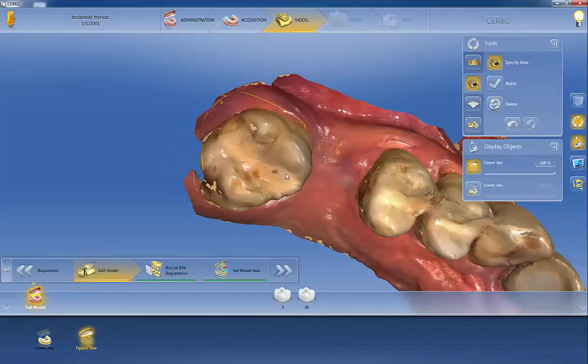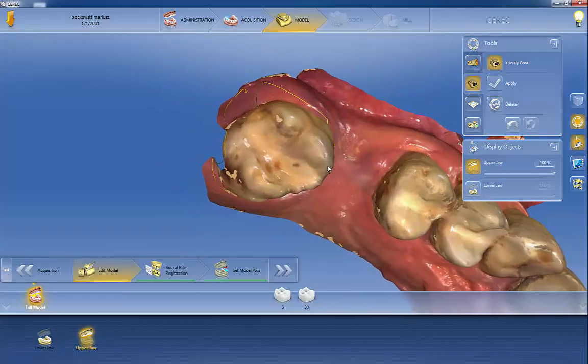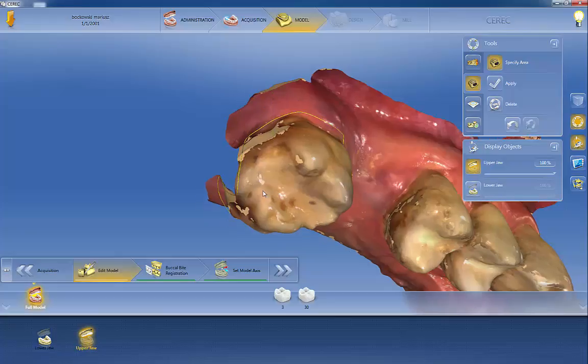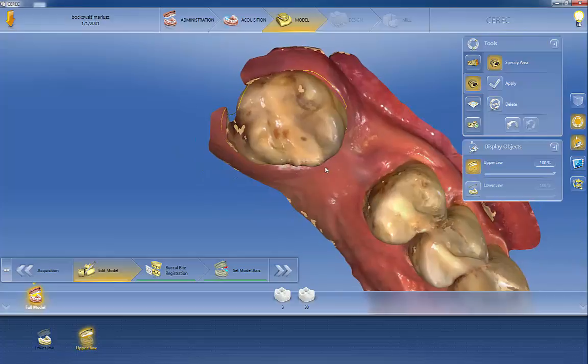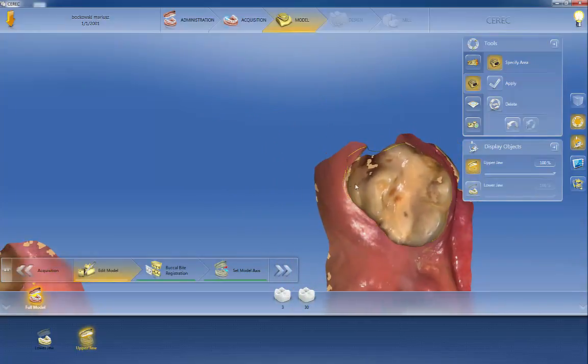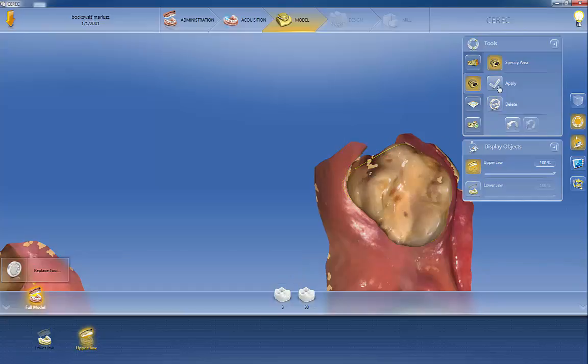And here we can see I made some errors in the line drawing, so as we can look closer here, we can see right in here where my lines are incorrect. And then let's go ahead and get that fixed up here as well. Just like so, click apply.